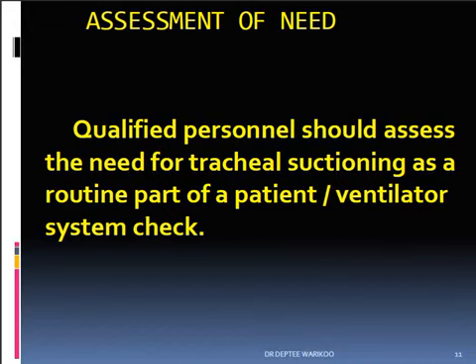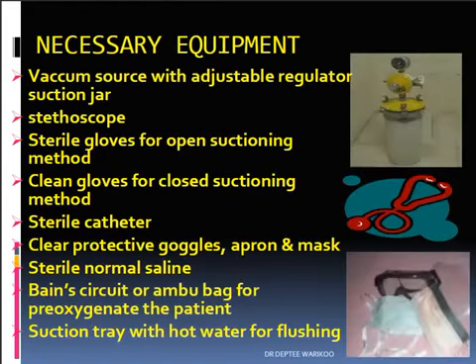First we will assess. Qualified personnel should assess the need for tracheal suctioning as a routine part of patient ventilator system check. So first you should take a proper person who knows how to perform suctioning properly. Then what are the equipments which are mainly used for suctioning?